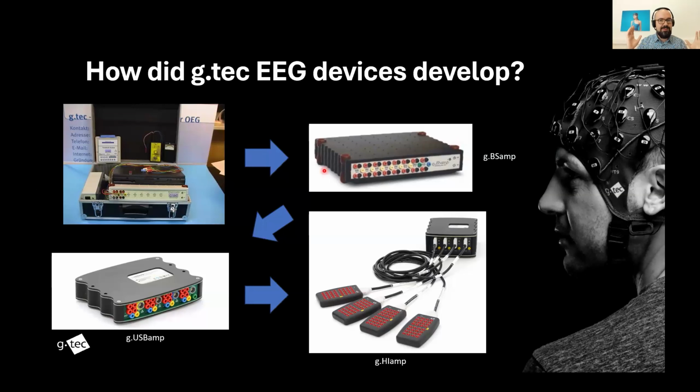There are still people using this amplifier today, so it's like a war machine. It doesn't get destroyed. And many people really like passive electrodes and passive EEG recordings because of how low the impedance needs to be so that the EEG can actually be visualized, and that obviously also stabilizes the EEG across the whole measurement.